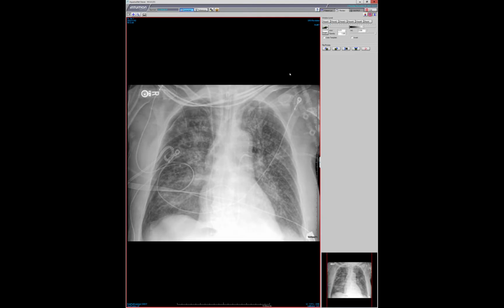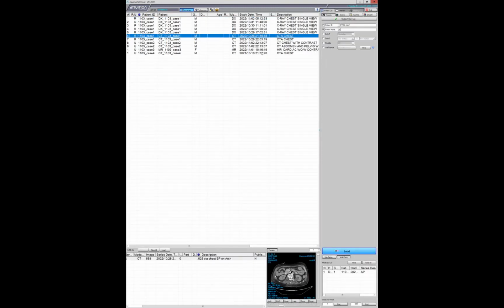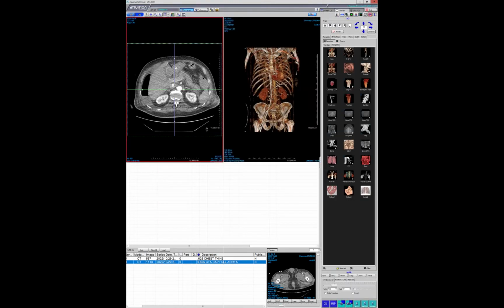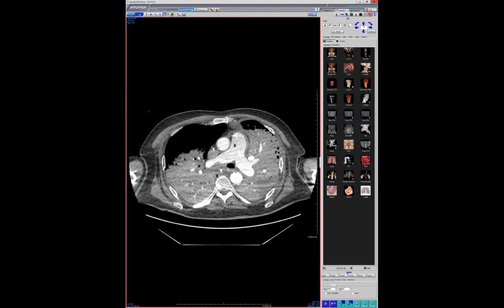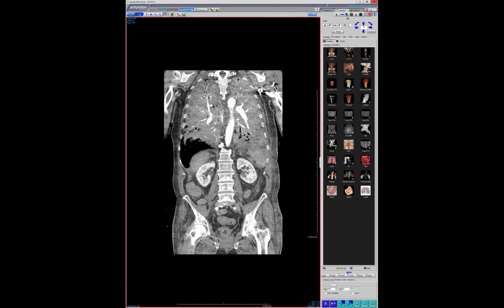And sometimes, in addition to that, the central airways contain secretions, sometimes the trachea contains secretions. But my interpretation would be that he had primarily atelectatic but recruitable lung. And maybe your best chance of working that out is to try and find out the tidal volumes they were inflating these lungs with.